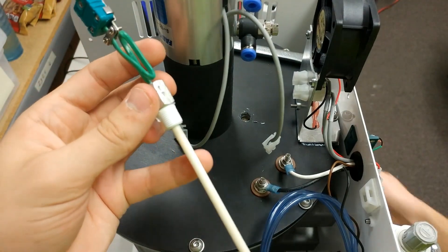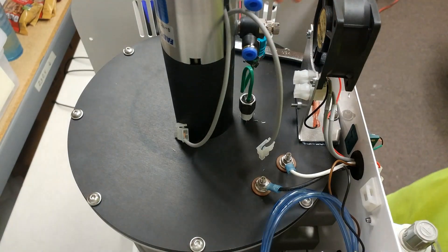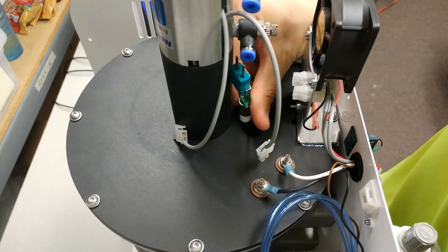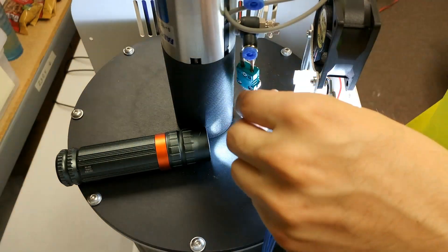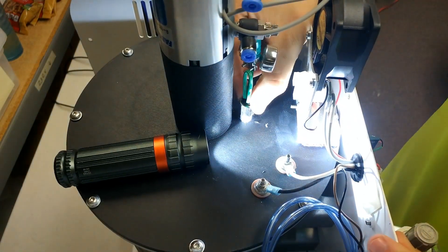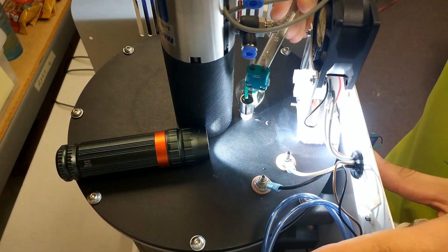Once you have reapplied your Teflon tape or grabbed your new thermocouple, go ahead and insert it into the thermocouple slot in your muffle plate. Once inserted, only turn the thermocouple enough to get it started and catch on to the threads. Once they catch, locate the black line or numbers you marked on your thermocouple and rotate — tighten the thermocouple three full rotations. Once done, we will continue to check where the thermocouple sits on the inside of the furnace to make sure it is lined up correctly.